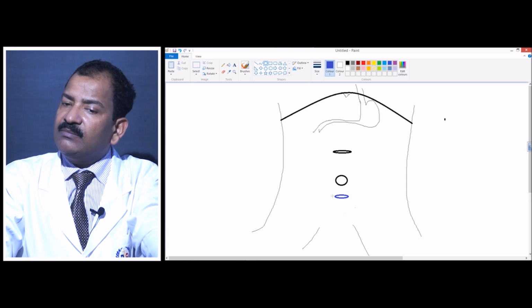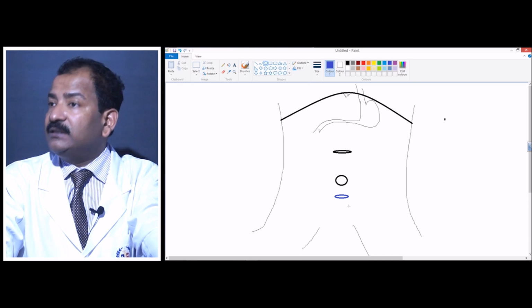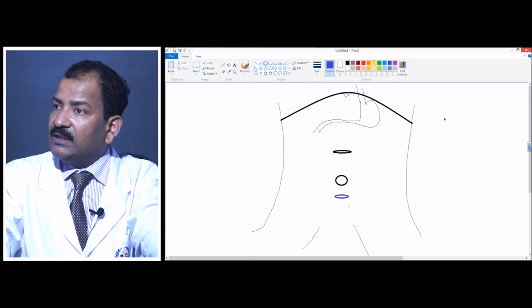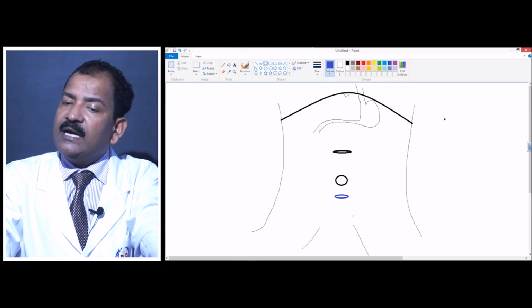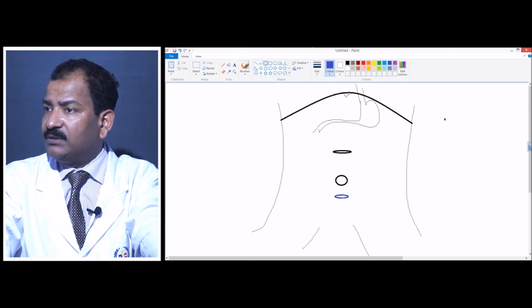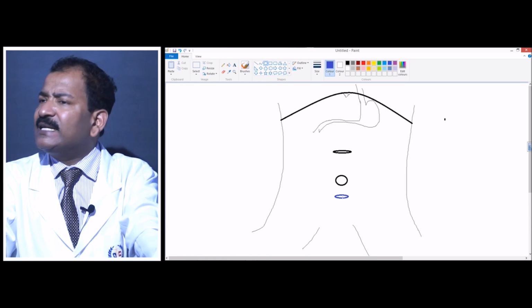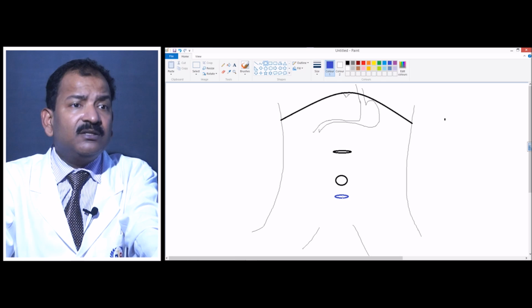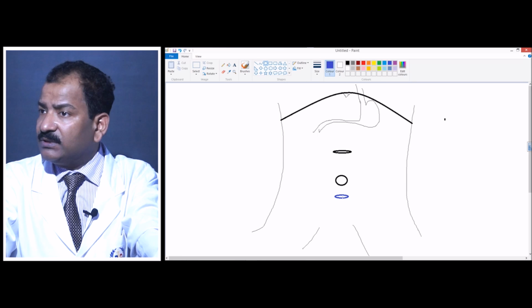In gynae procedures it may be 3 centimeter below the umbilicus directly, because your target is the pelvis. So in gynae procedures only 3 centimeter below, and it is only used for simple procedures like LUNA, presacral neurectomy or sometimes sterilization, that is all. It is not used at all for hysterectomy or ovarian cystectomy.